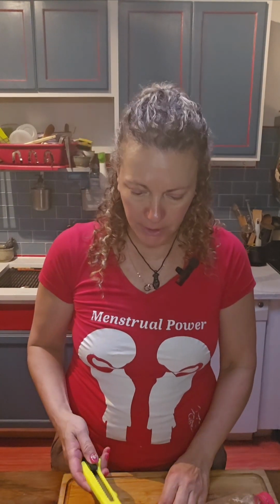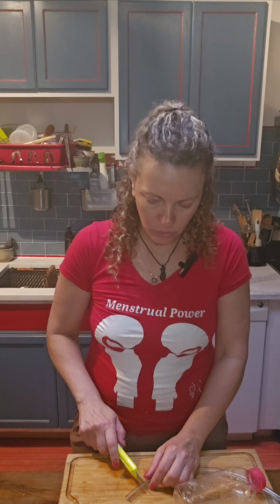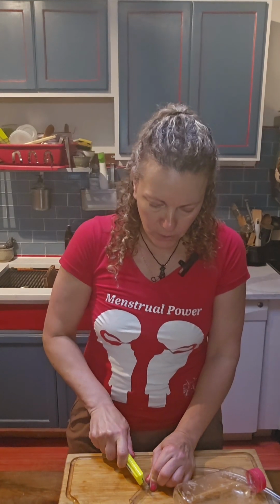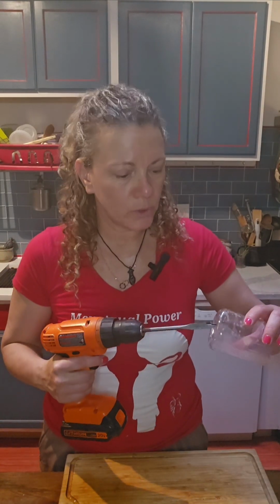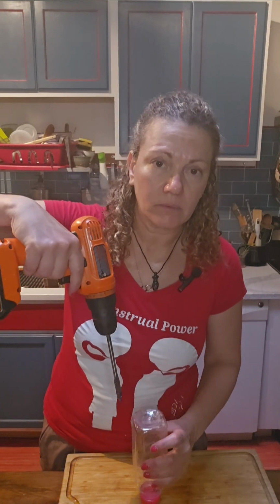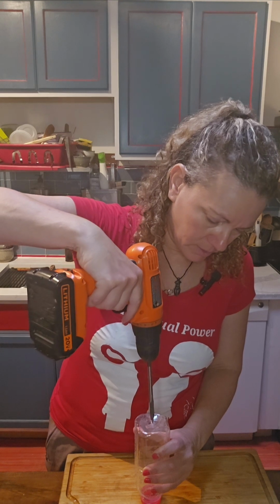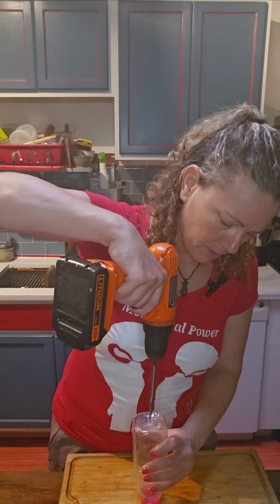So we'll cut part of the tube, which is going to be our cervix. And now I'm going to drill a hole at the bottom. So I can do it like this. I want to make it in the middle.